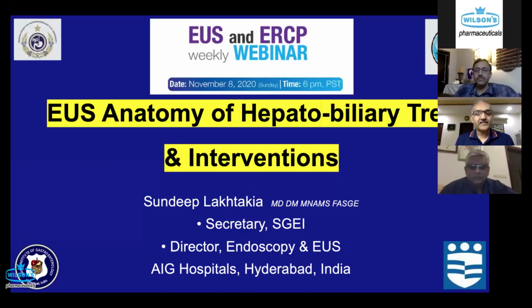So, as Professor Gas said, I'll be speaking on EUS anatomy of the hepatobiliary tree, which was the topic allotted to me. But I thought I'll add the word interventions to make it more interesting and for people to be glued in to whatever we speak and discuss later on.